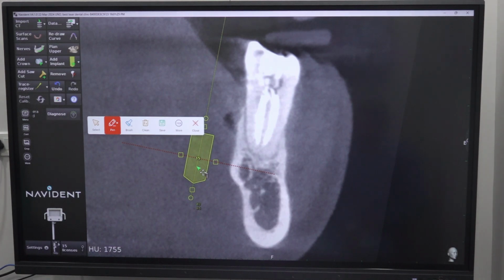So see the interdental bone. No? It is good, but this interdental bone won't be there after extraction. Right? It's a thin septum. So the 6 mesial distal thing will work out. So we are going for between 6 and 7.